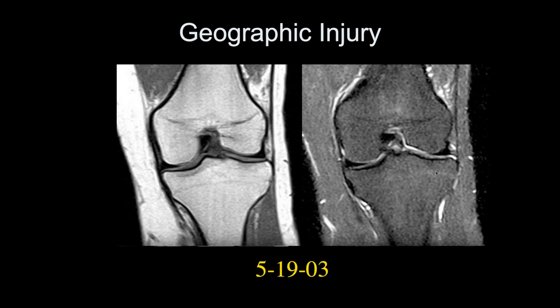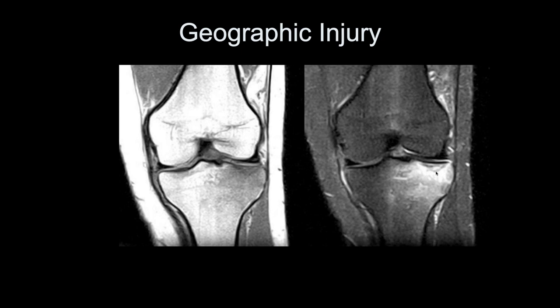Here we are. I think that's too much. I think that's a valgus injury with the compression. Right. I don't think this is an insufficiency fracture. Correct. I agree.